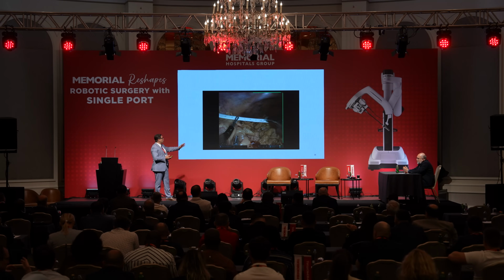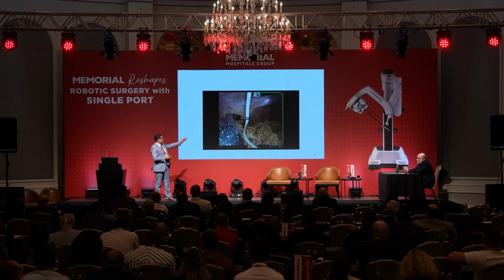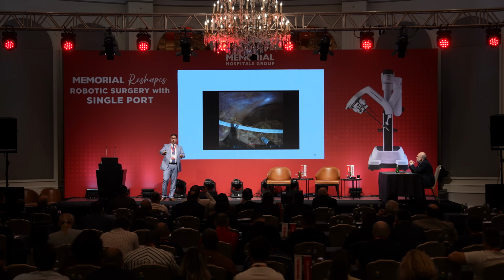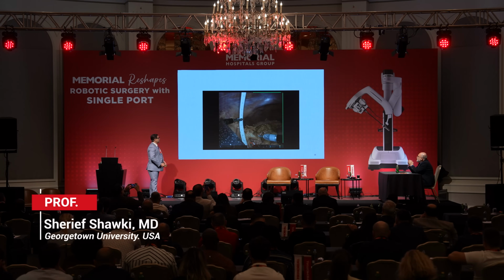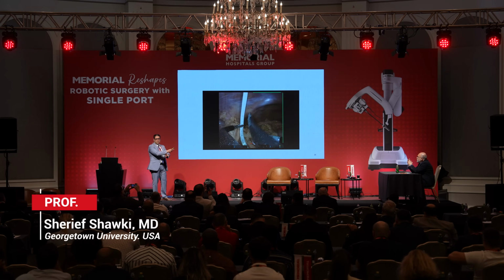And this is showing you the distance that I was telling you about, and you can go up and down without a problem. Between two arms, you can go lateral, and you can cross 4 centimeters, lateral 7 to 8 centimeters. But two arms next to each other, you cannot cross. It's going to be difficult.